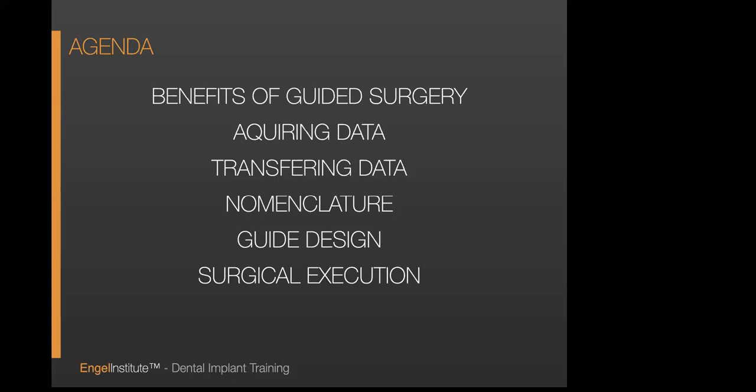And then we'll go into guide design. Guide design is all predicated on what you give the guide maker, whether that's you or 3D Diagnostics or anything else. Much like your crowns, you give a lab a really nice margin, you're going to get a really nice crown. So it's imperative that we focus on that as well. Guide design, it's not arbitrary. It's all by algorithm to make your surgery as easy as it can be, namely access. So the algorithm will give you the shortest distance to perform your procedure in the mouth without having opening limitations.